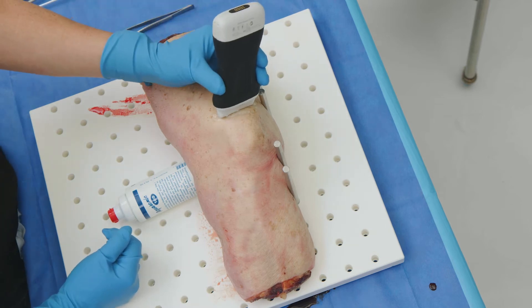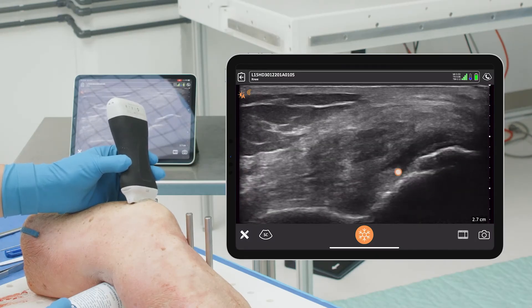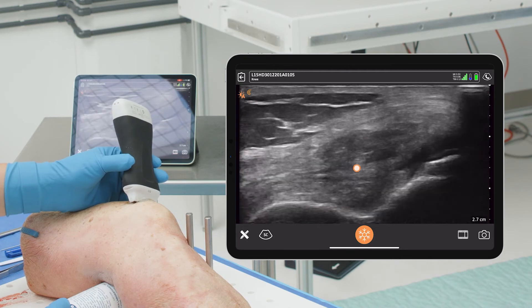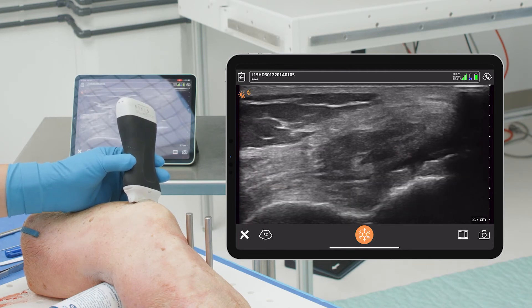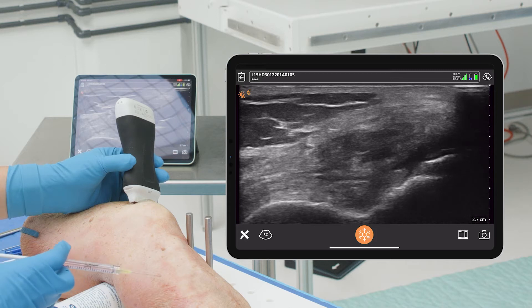We're going to come and just look at that suprapatellar region. We can see very nicely this space — you can see where the fat pad is and the quad tendon. If we're going to do an injection, this is my preferred way to do injections, this direction.